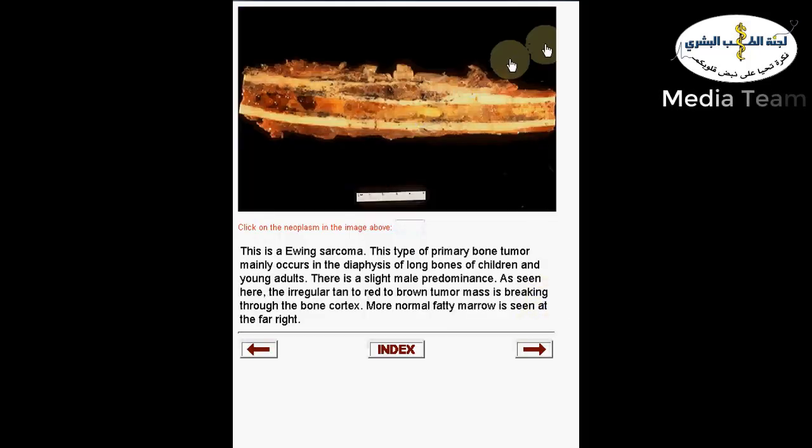Now we are going to cover another bone tumor, another bone sarcoma. Now if you look carefully, please stop side talks there at the end.